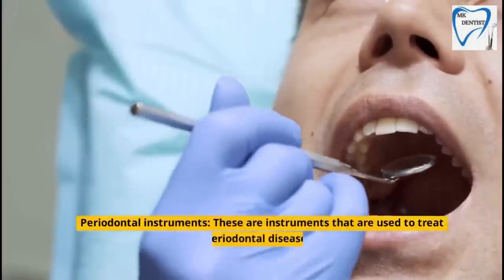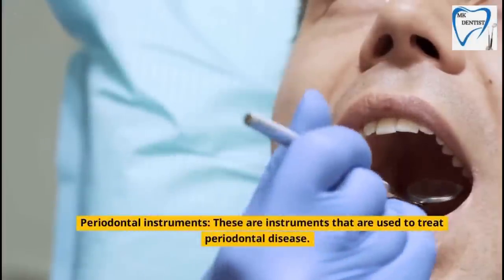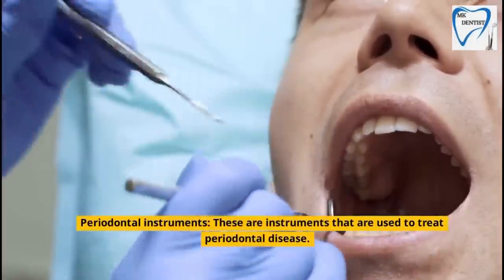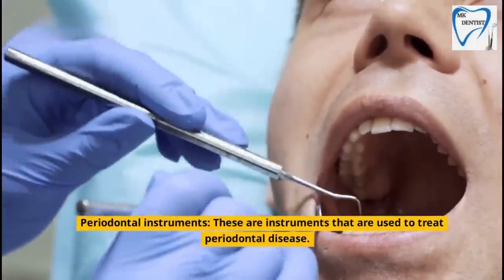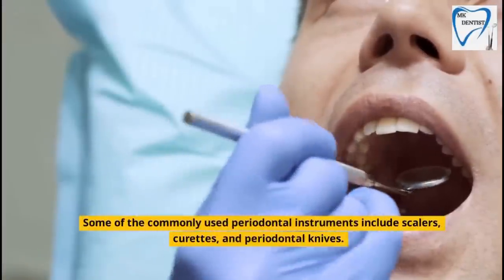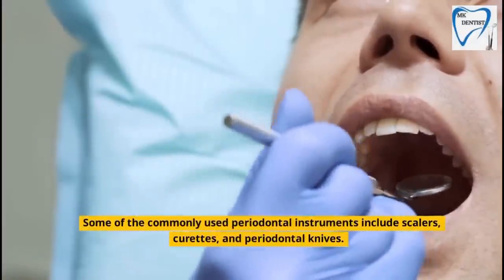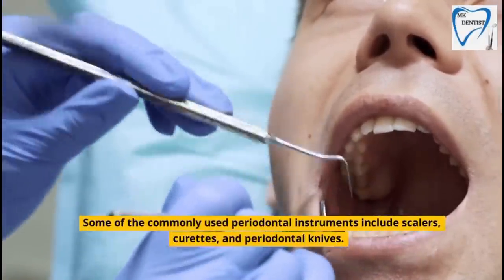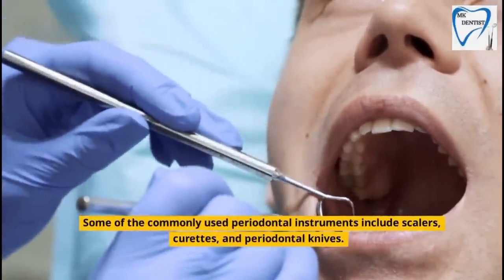Periodontal instruments are instruments that are used to treat periodontal disease. Some of the commonly used periodontal instruments include scalers, curettes, and periodontal knives.